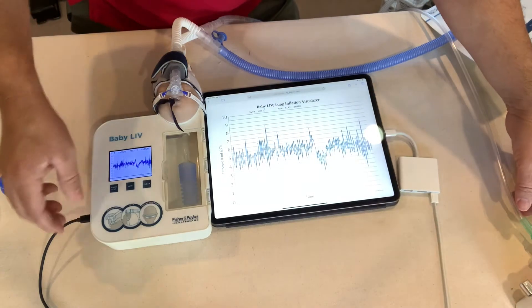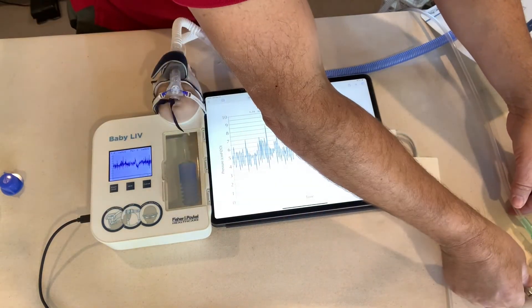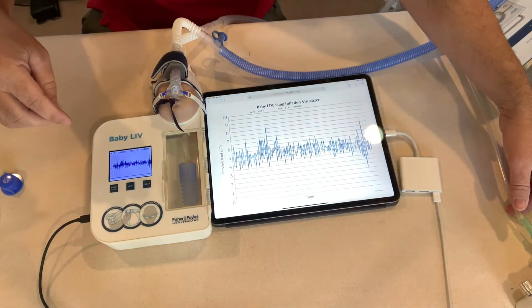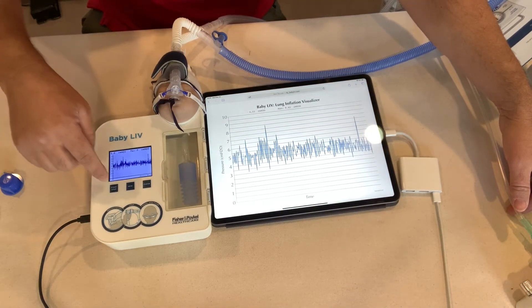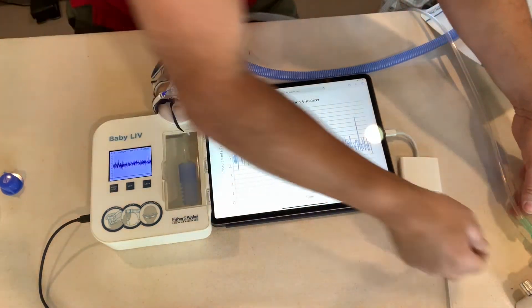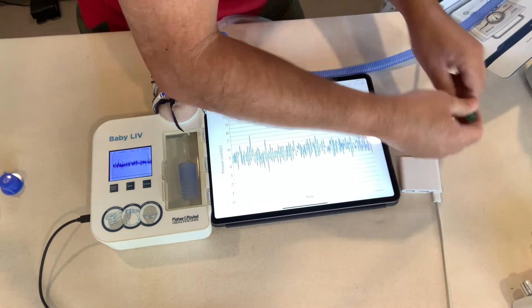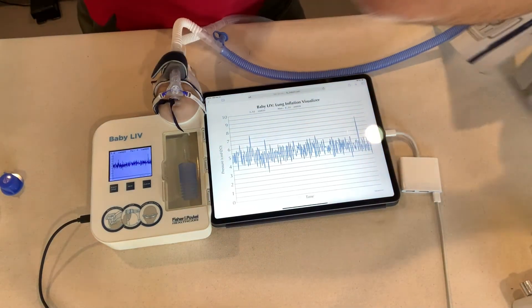Let me go ahead and stop this real quick so we get a reading. We got a baseline — let's turn this off and bring in the Neopuff.